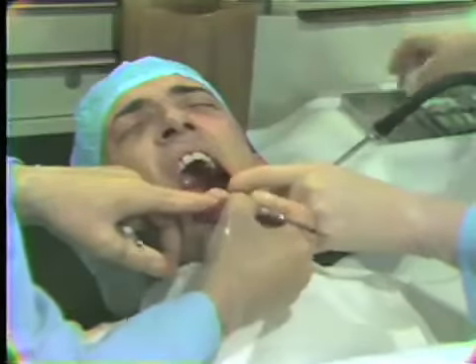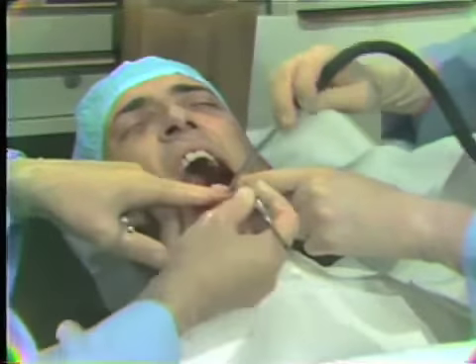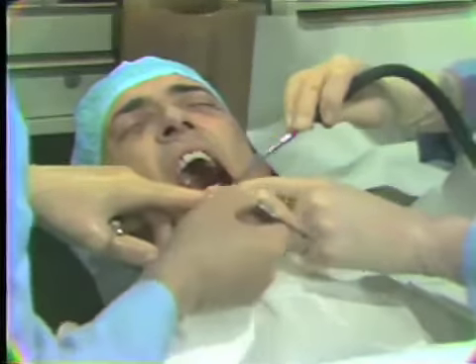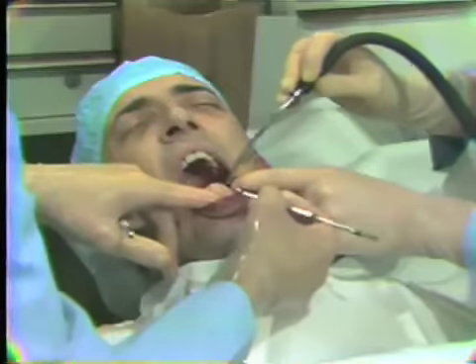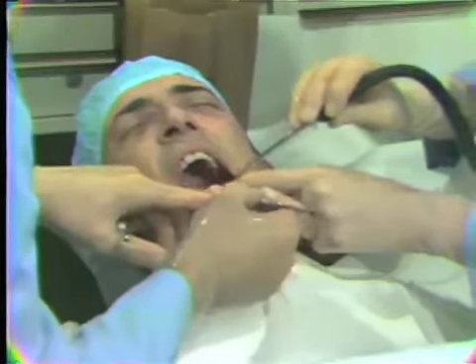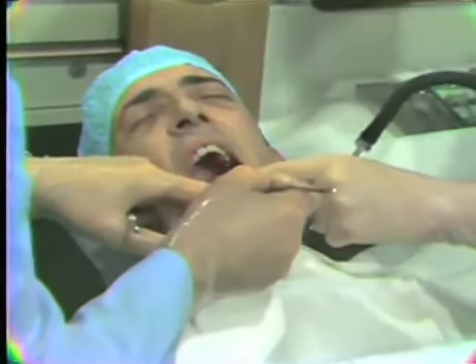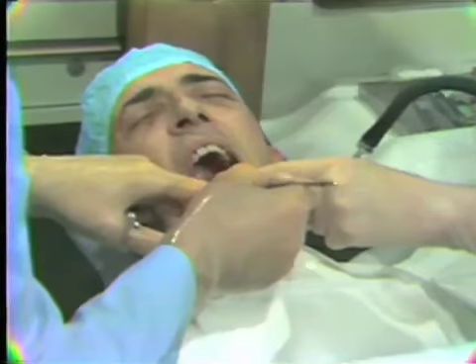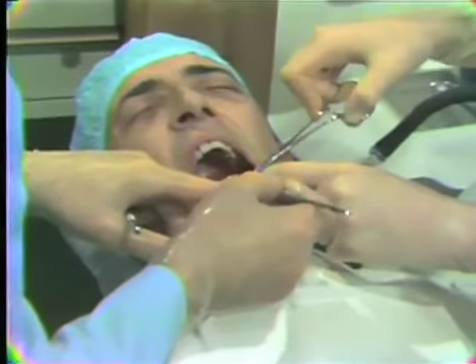There upon occasion may be little tags of tissue, pieces of tissue that we're not able to clearly visualize, and many times it's helpful for the assistant to attempt to hold the tag of tissue so that we may see it more clearly, so that we may determine the attachment of the tag of tissue, and in doing so, finding where the attachment is, we can displace it with the curette.